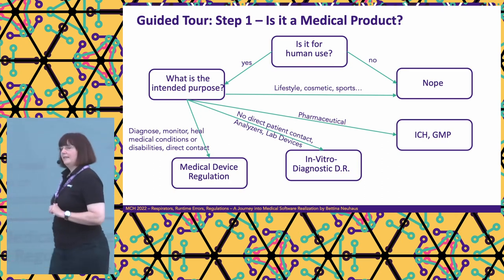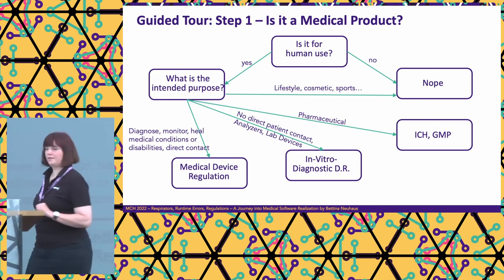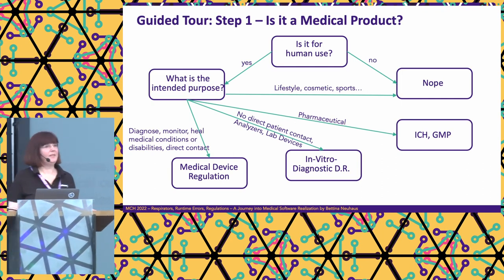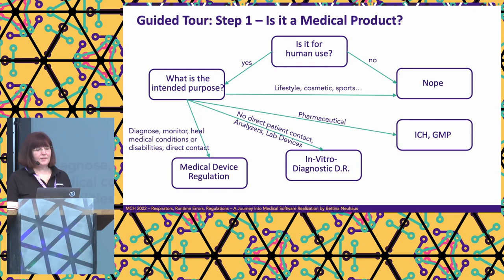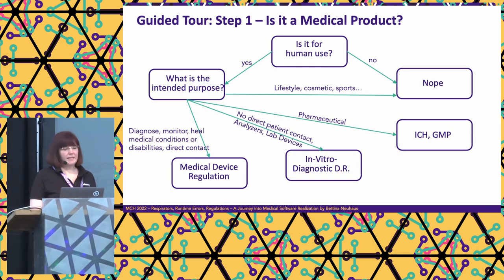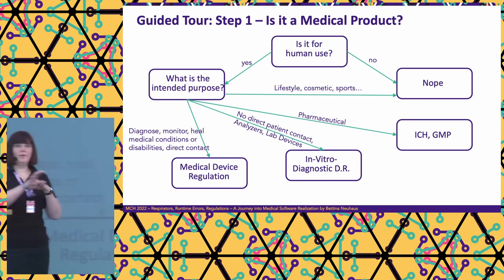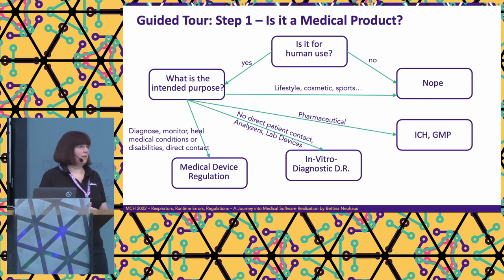So you can decide a little bit if your product is for medical use or not, if you have to follow the regulations or not. And if you don't, then it's not a medical product and it can't be used in that field, of course. Okay, so also, is it a lifestyle product or something like that? Then it's not a medical product, but if it is, for example, somewhere in touch with the human body, like diagnose systems or the implants that I just talked about, then it falls under the medical device regulation.